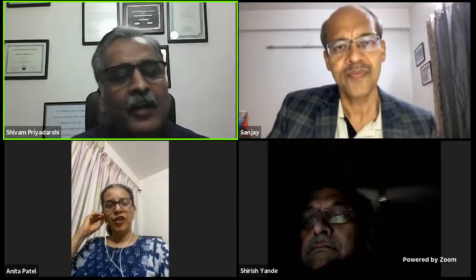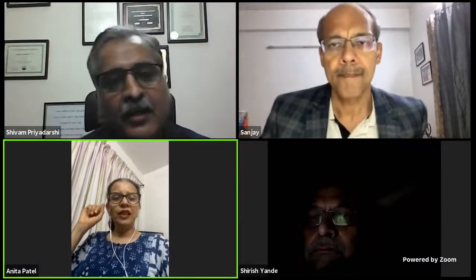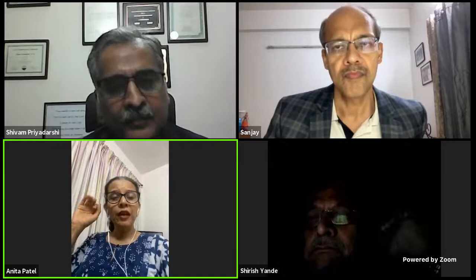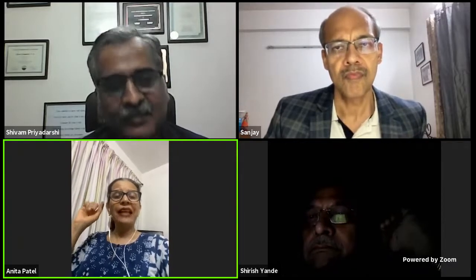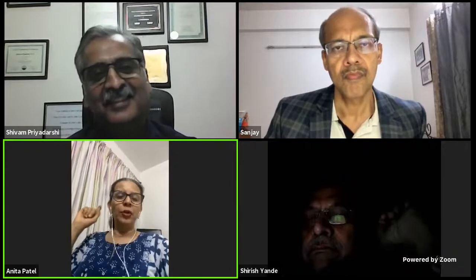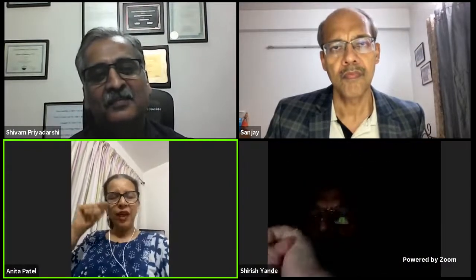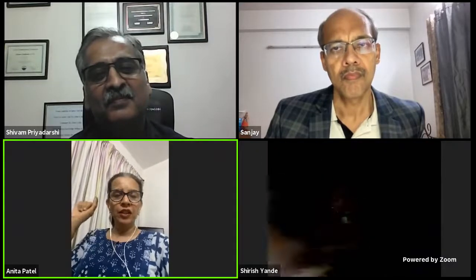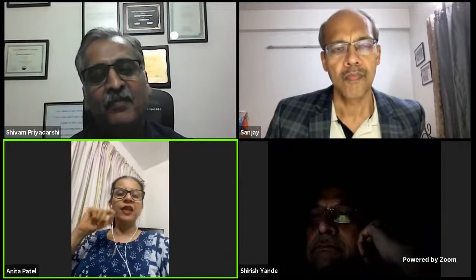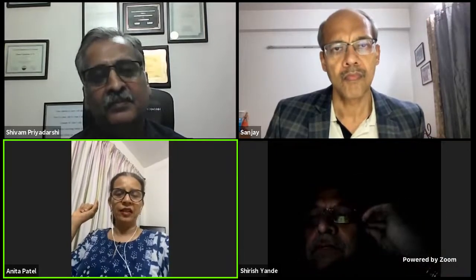All right. Dr. Shivam, can I just add something? Yes, please. There is a tendency to say that this is an invasive test, it's an expensive test, we don't have it available at our place, and hence there is a justification for not doing it. But urodynamics is far cheaper than doing a wrong surgery. It is far less invasive than operating on somebody when it is not indicated.